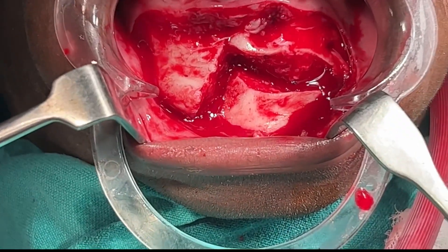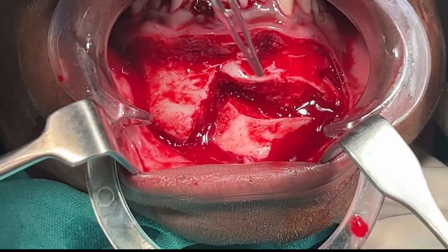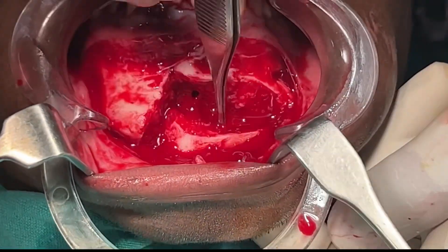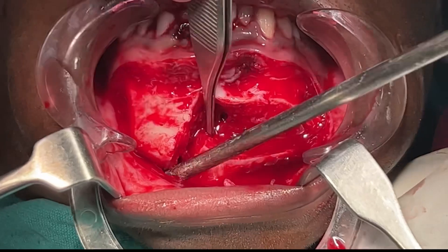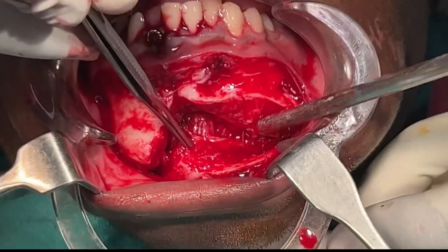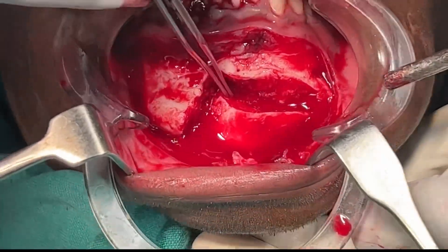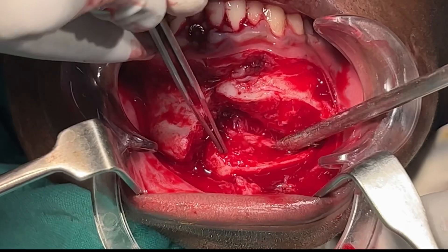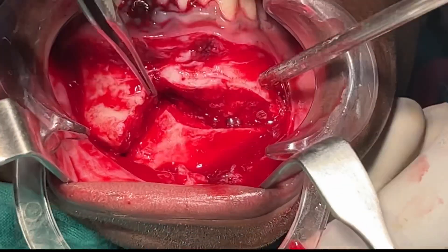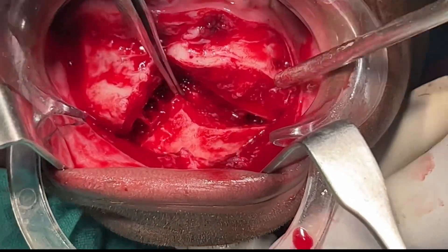We've got this fracture now — to move it you have to reduce it. You can see the muscle attachments inside, and that's what's pulling the fracture segment and displacing it.